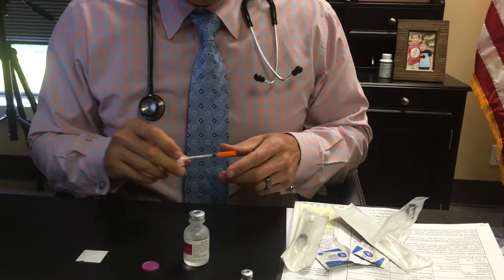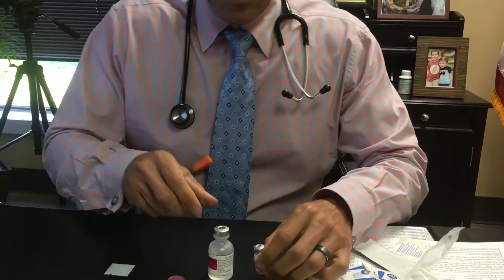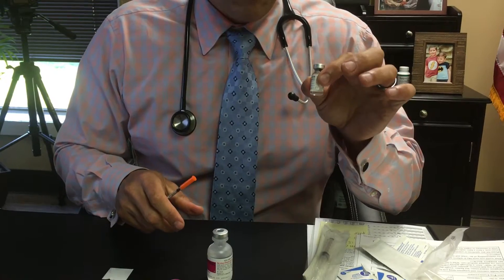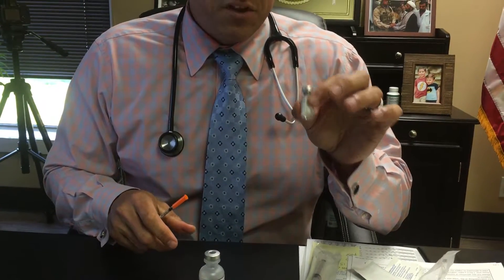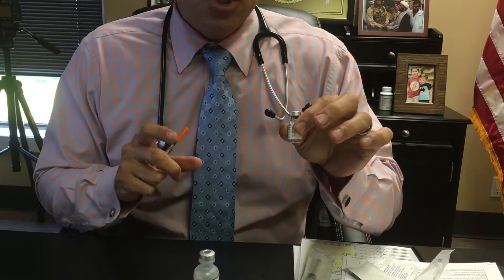Now that you have this bottle of Omnitrope mixed, you're going to keep it cold in the refrigerator. It's very important that it stays cold once it's mixed. If you leave it out overnight that's fine — it just can't be unrefrigerated for more than 24 hours.